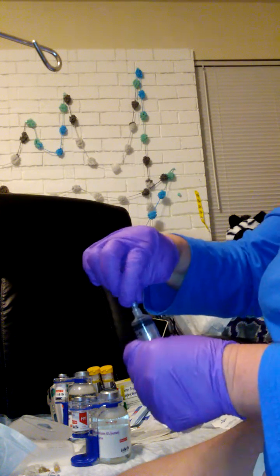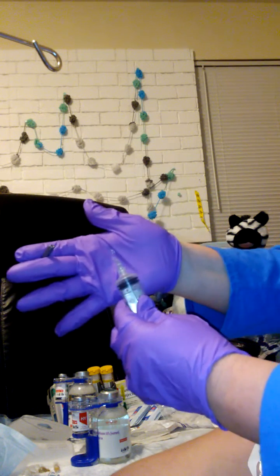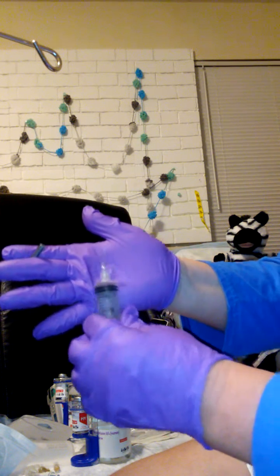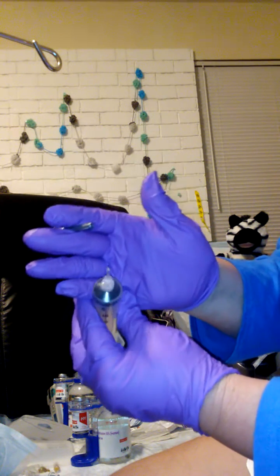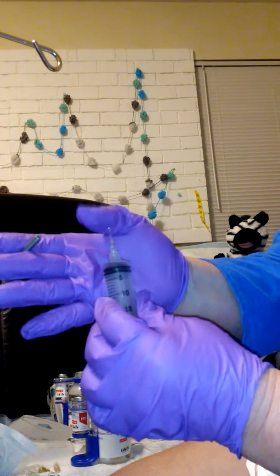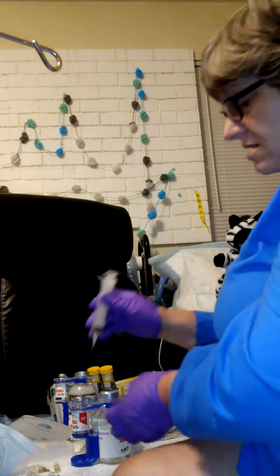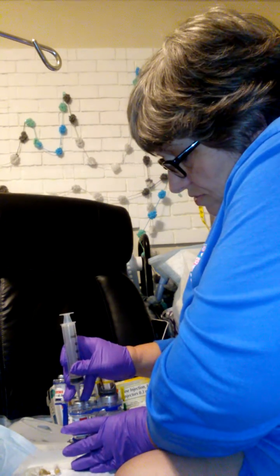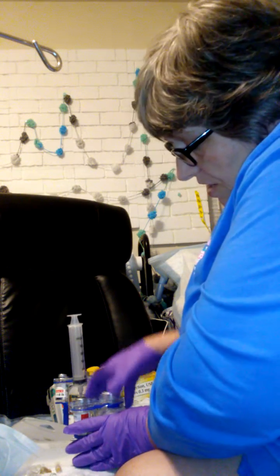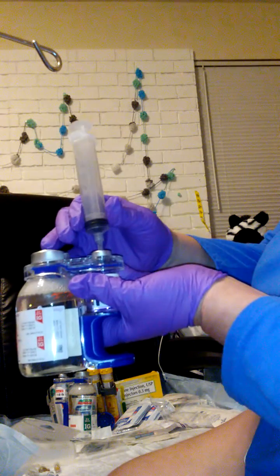I'm going to put it right on here, pull this off, and give you a look-see at that. Hoping that's focusing in so you can see. It is not a sharp needle, but it is sharp enough to go through the top of this vial. And I'm going to just push this straight down in through here. There we go. Okey-dokey. So you can see it's gone inside.